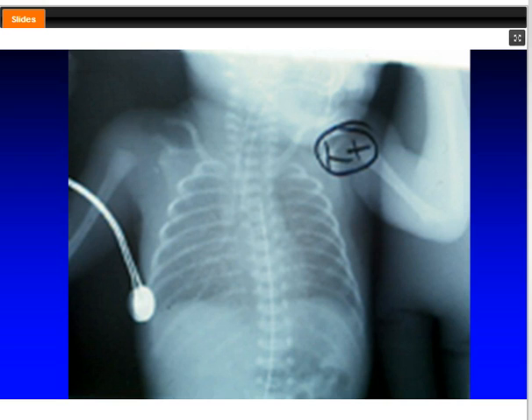So part of weaning a baby who's been on a ventilator more than a week is reducing the frequency, but also reducing the tidal volume at the same time because you won't need as much tidal volume because the lung will no longer be overdistended.